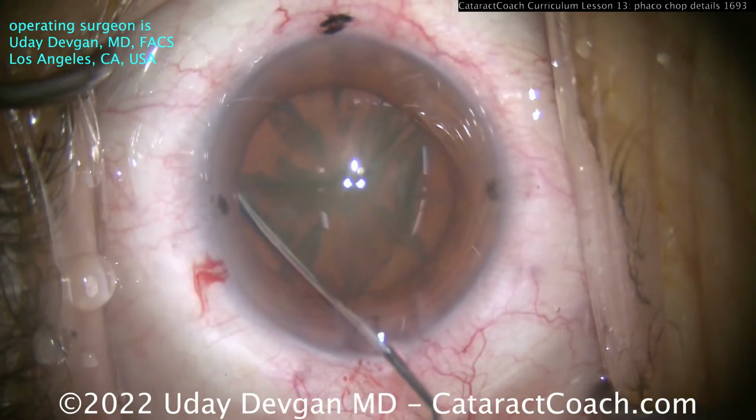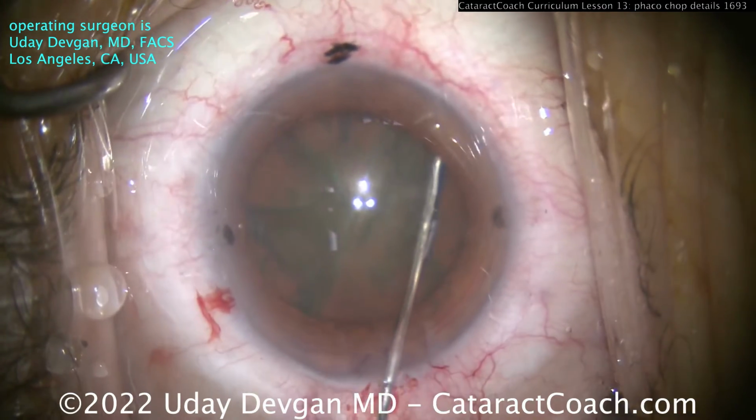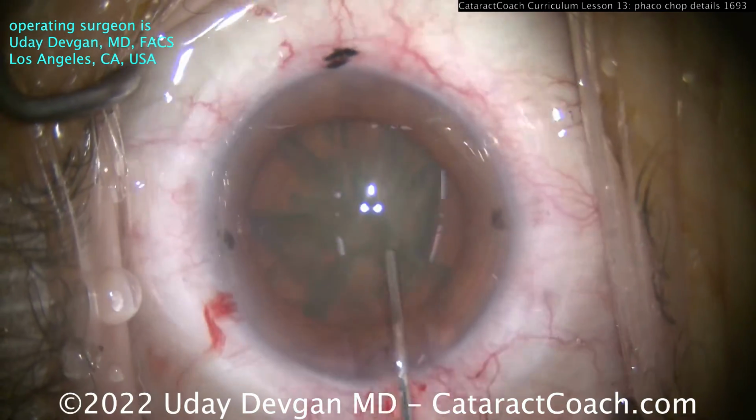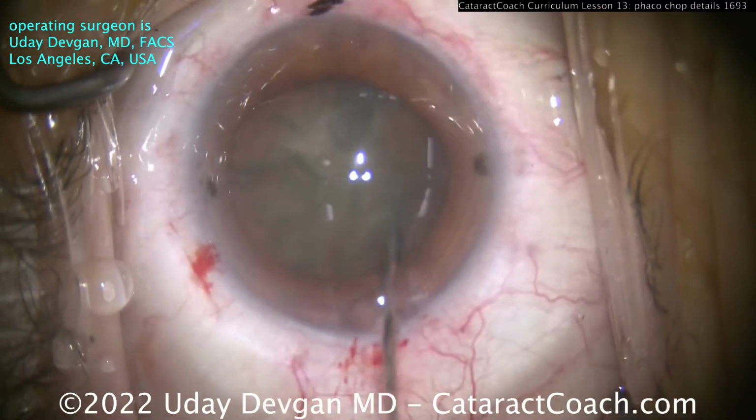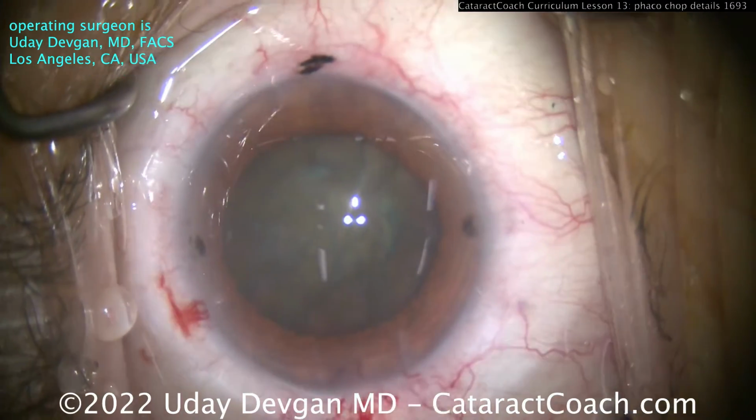So now hydrodissection is important to free up that nucleus. We'll tap the center there. And you really want this nucleus to be able to spin a little bit. So we'll try to spin it. And there it is. It's got good spin to it. So you know it's free from the capsular bag attachments.